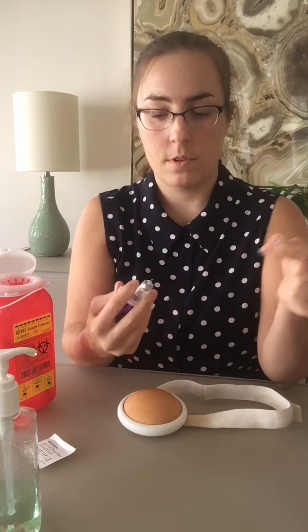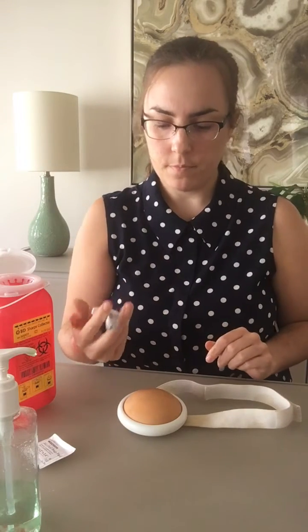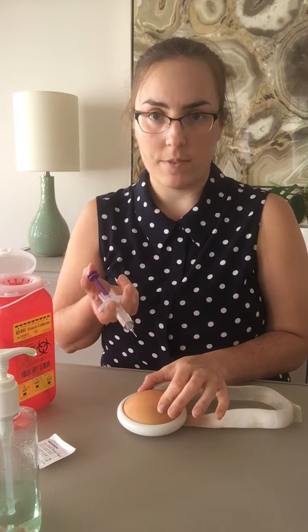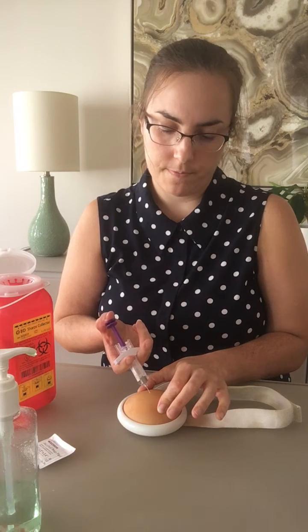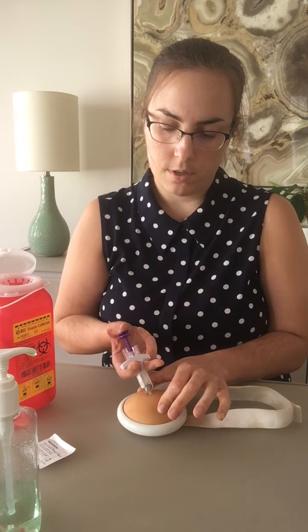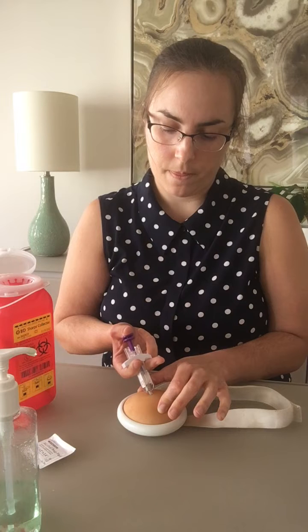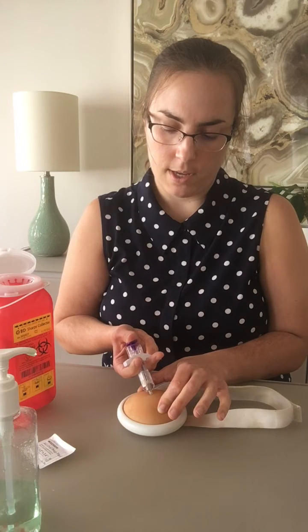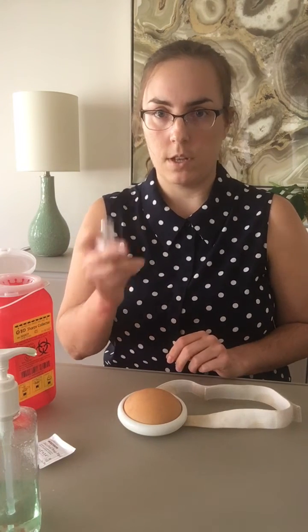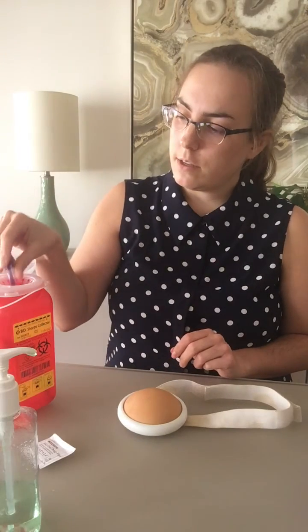Now you're going to remove the cap — never recap. You're going to take the skin, pinch it, and at a 45 degree angle you're going to inject. Once you're in, you're going to slowly press the plunger until you're fully in. When you're done, the needle will automatically retract. Then it goes into a sharps container. A little bit of bleeding is perfectly normal, and that's about it.